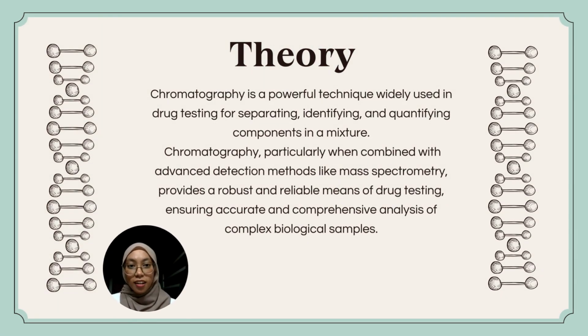My name is Nurfatiha, and I will talk about a little bit of theory about chromatography in drug testing. Chromatography is a powerful technique widely used in drug testing for separating, identifying, and quantifying components in a mixture. Particularly when it's combined with advanced detection methods like mass spectrometry, it provides a robust and reliable means of drug testing. It ensures accurate and comprehensive analysis of complex biological samples.